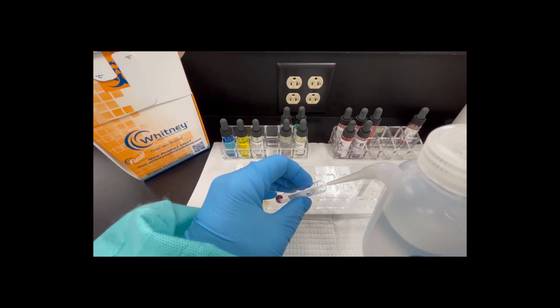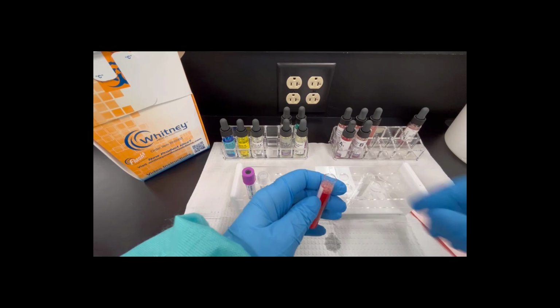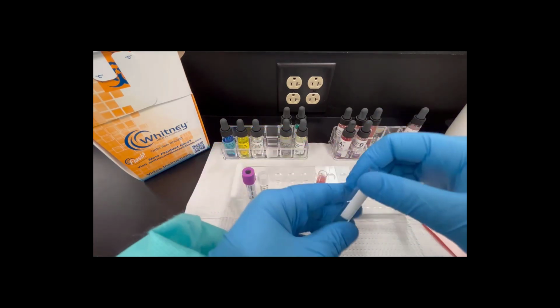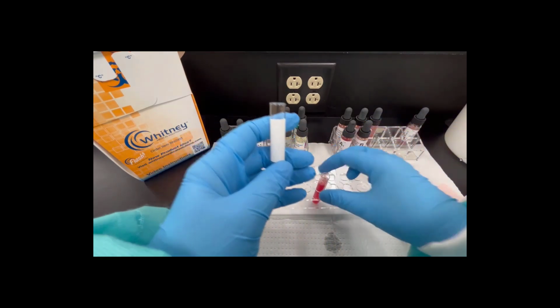So I'm going to go in and we're going to do this. Did you hear that? That's what I'm looking for. So I've got it this full. It's a little fuller than I like it to be, but these tubes are small. You can also note that the cells are off the bottom, so I know I got a good wash.